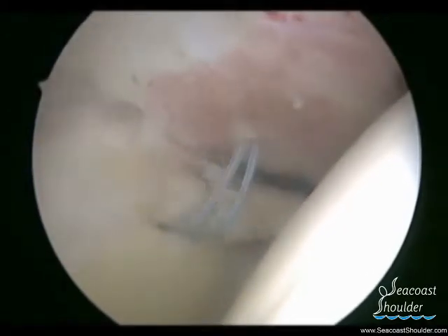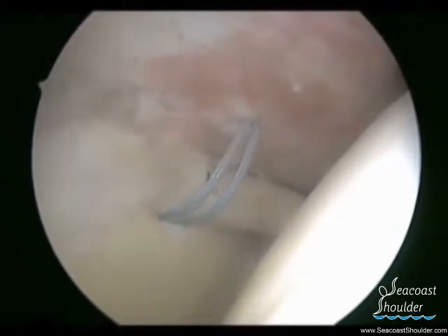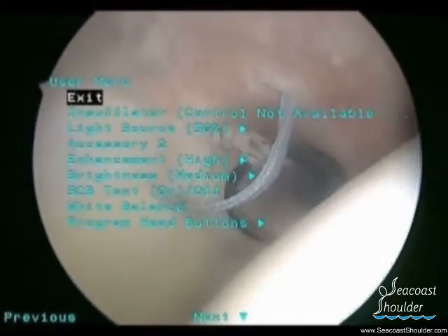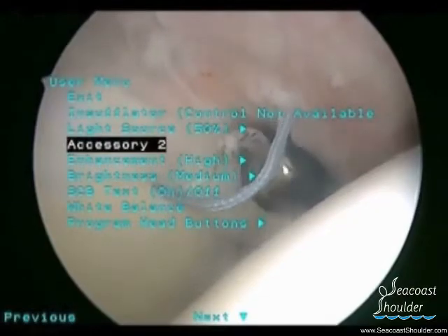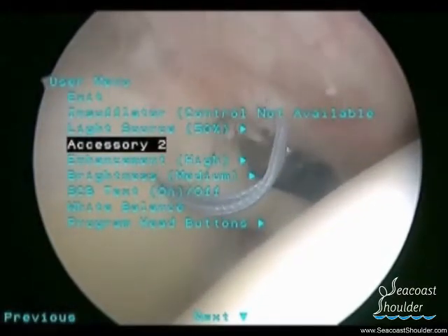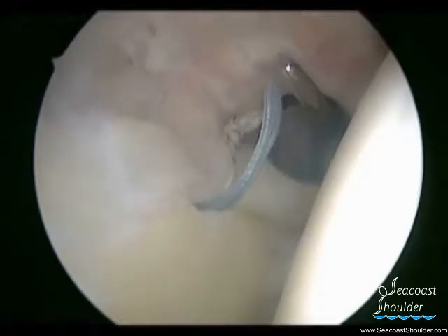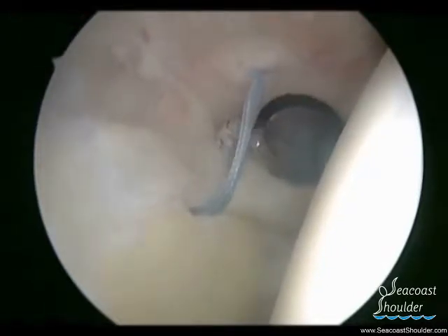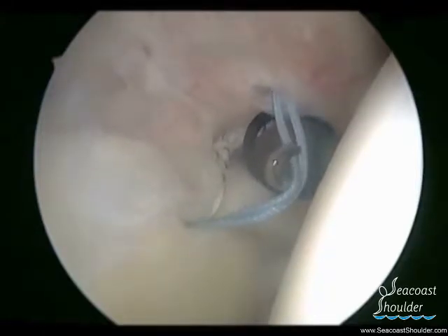Once the knot is secured, the excess suture material is cut and removed. The tissue passing device is then brought in again to pierce through the labrum so that we can then pass the blue suture.